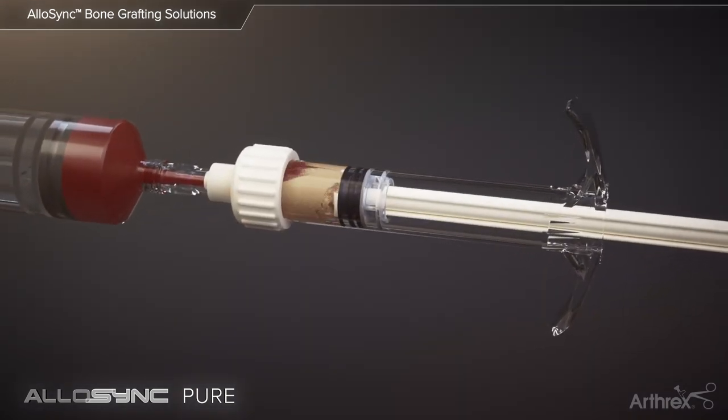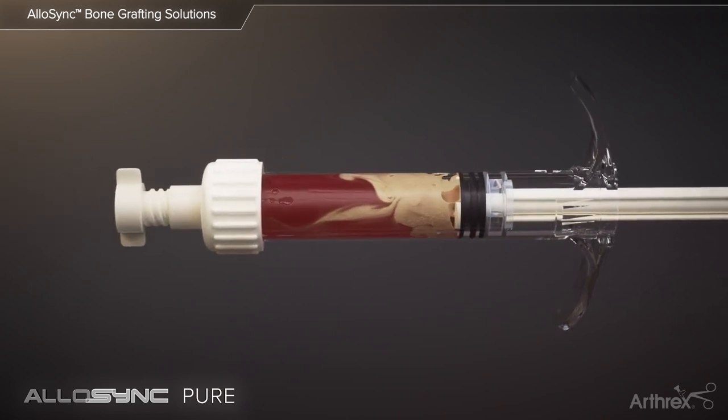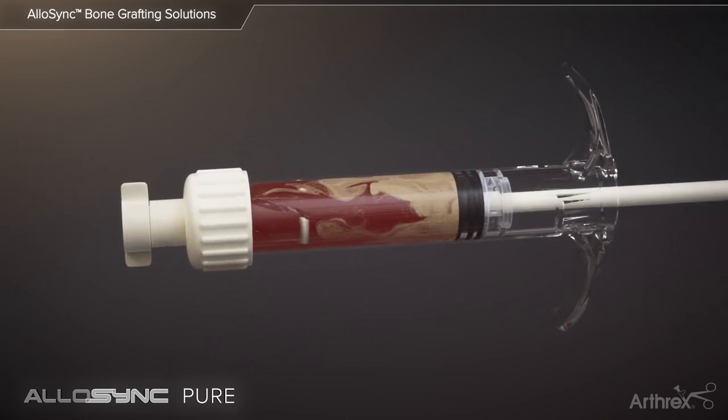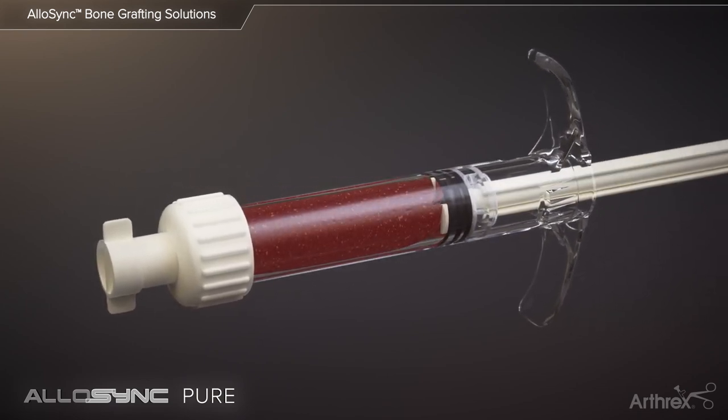Alternatively, Allosync Pure can be prepared using the ABS-2000 mixing syringe. The graft and biologic fluid are added to the syringe and prepared with the internal mixing element until thoroughly mixed.